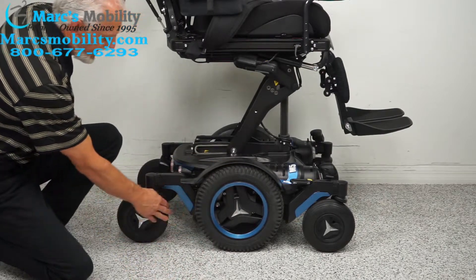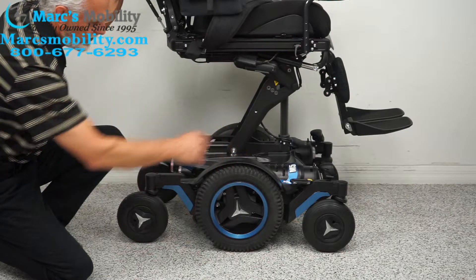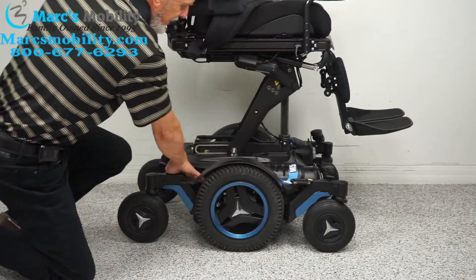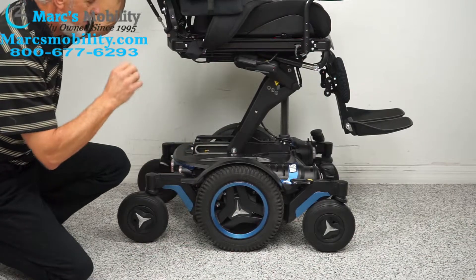There are eight-inch caster wheels in the front and eight-inch caster wheels in the back. You have an anchor point here and another one inside — this is where you secure the chair if you're going to transport it. Remember, this chair weighs at least 450 pounds.